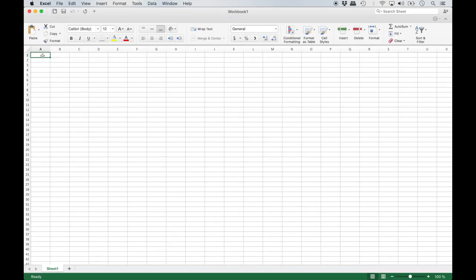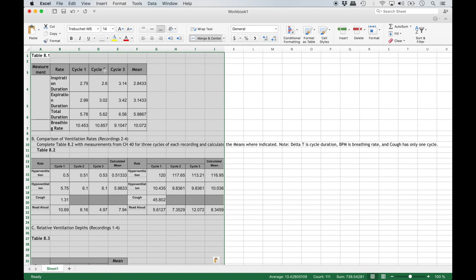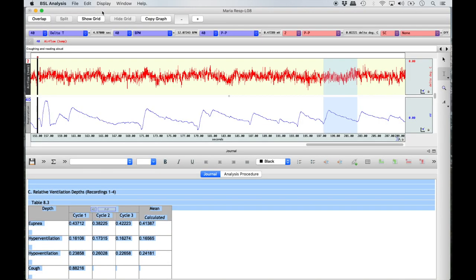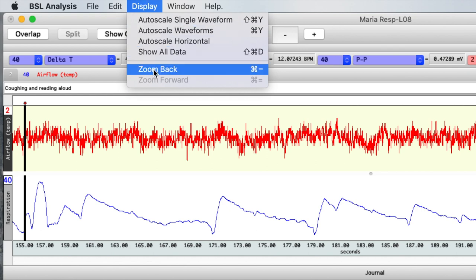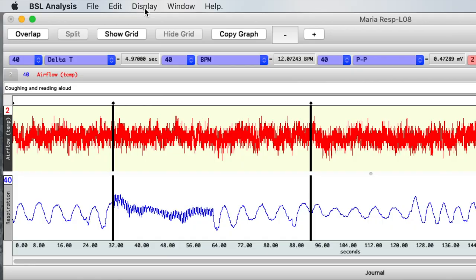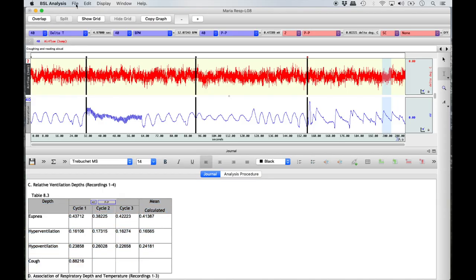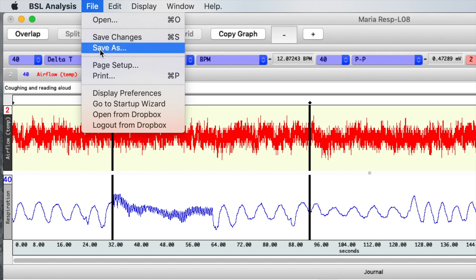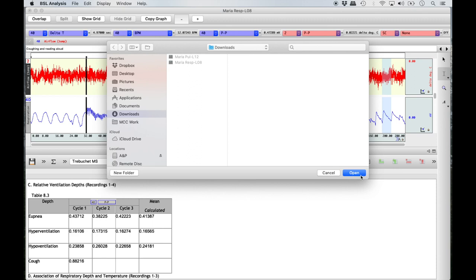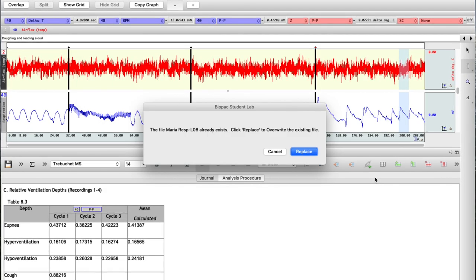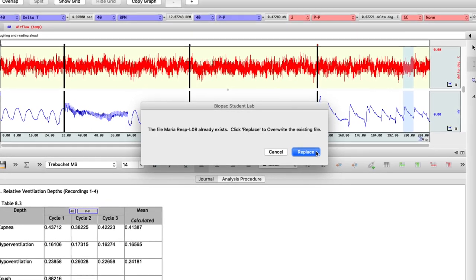Confirm with your instructor how they would like data presented if a lab report is required. When you are ready to save your data and close out the application, select Display from the top menu bar and then click Zoom Back until you have returned to the full screen view. Then select File from the top menu and then Save As. In the window that opens, select the same location from which you opened the lesson file — likely the downloads folder or a flash drive. A BSL window should then appear asking if you would like to overwrite the existing file — click Replace.